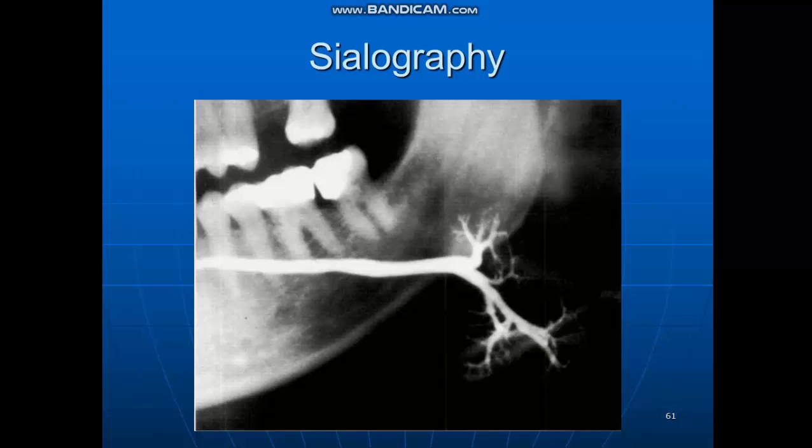The procedure is divided into three phases: the preoperative phase, the filling phase, and the emptying phase.